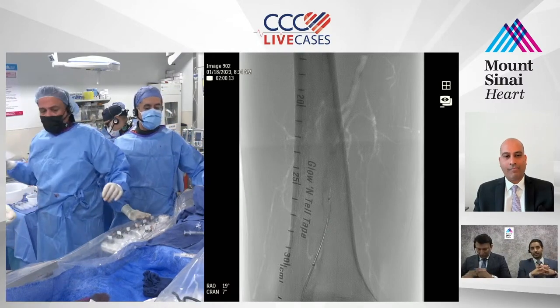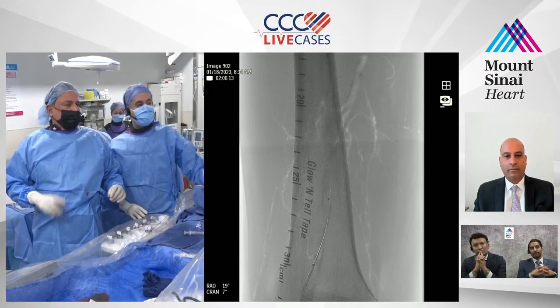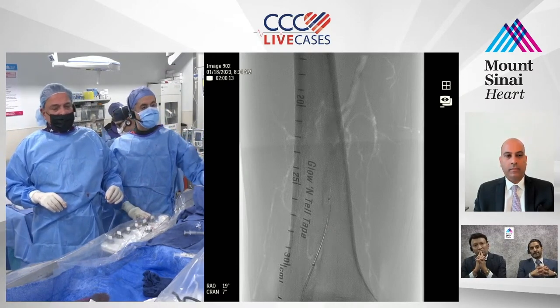Give me an 018. What is it called? Pull it back. Doing a starter. This one. No, starter. Let's try the 018 Connect 250T.